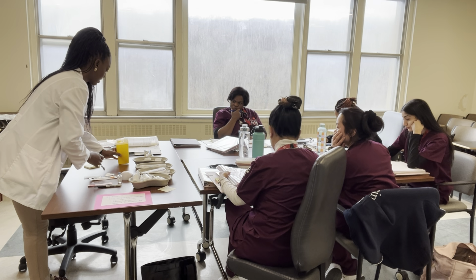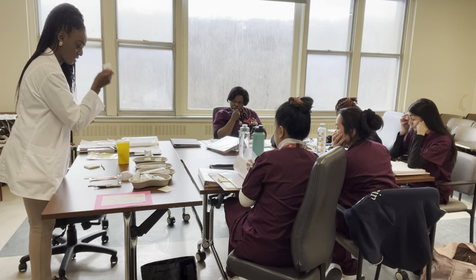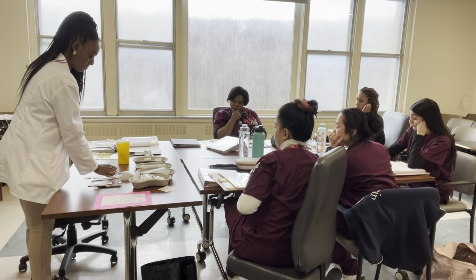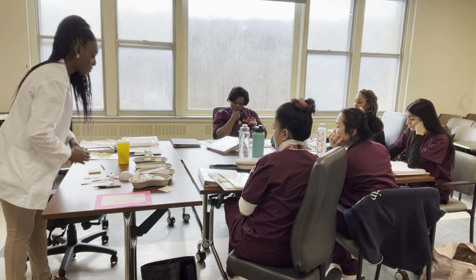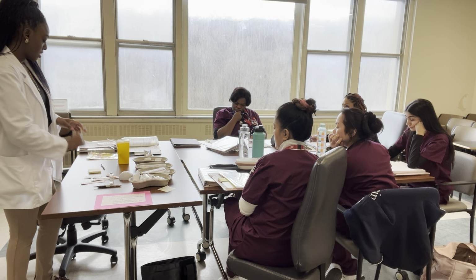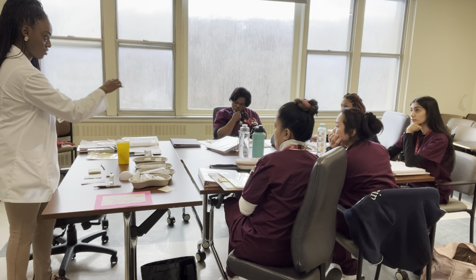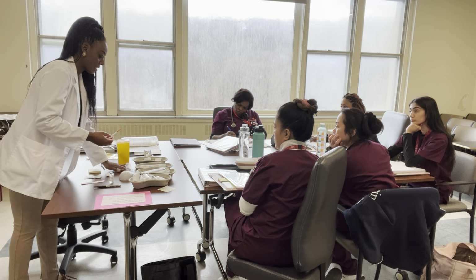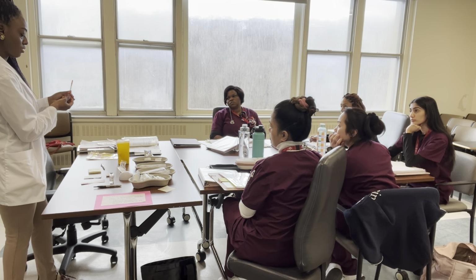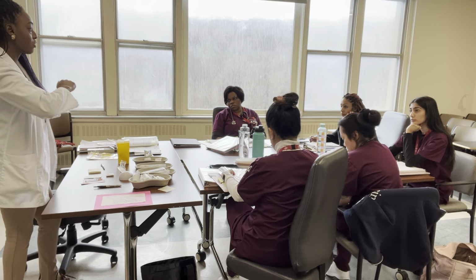So once you have everything planned out in your mind of how you're going to proceed, don't forget you need your 2x2 swab. We already have the identification of where we're going. So now we would prepare the insulin. When I open the syringe, you will all do this afterwards. I'll provide you all the supplies so you'll be able to do it. You open up the package. The first thing that you do, because it's brand new, we remove the cap.